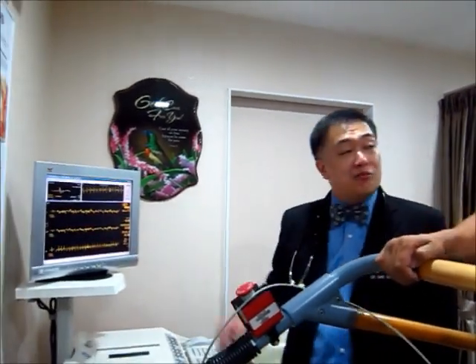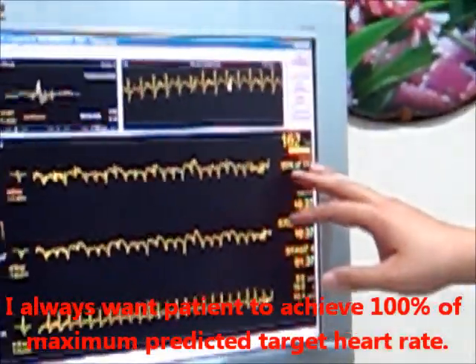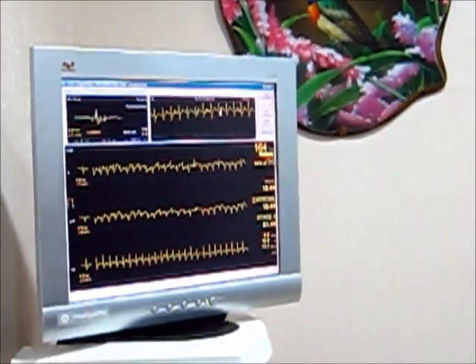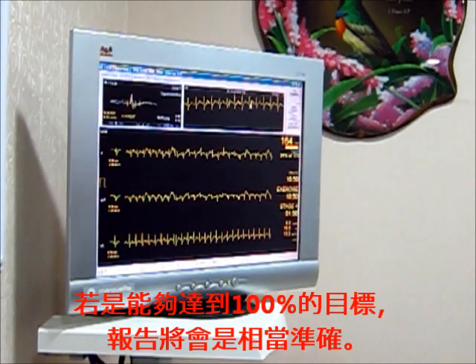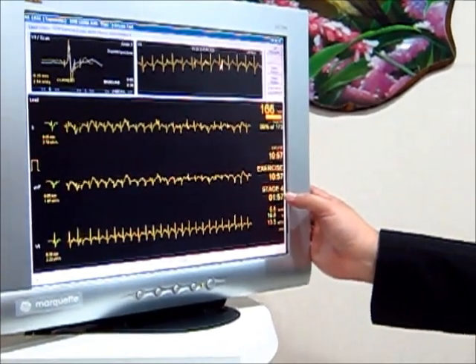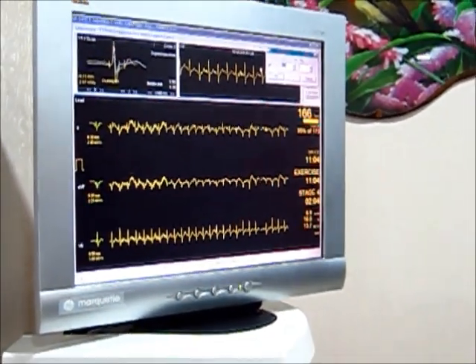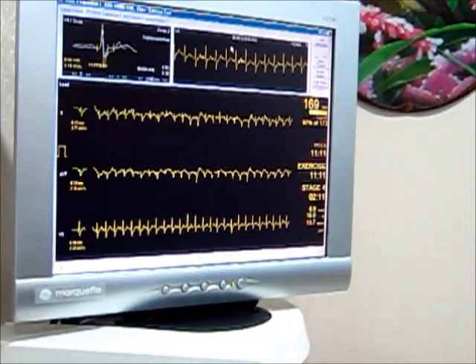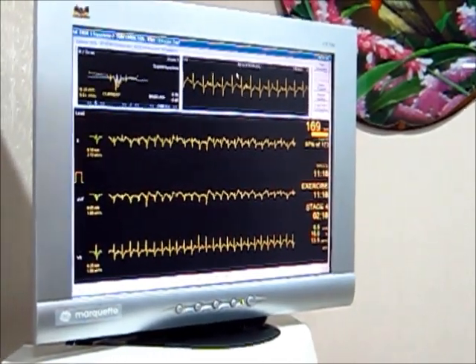Mr. Koh, you are at one and a half minutes of stage 4. Your heart rate is 162 beats per minute, with our target at 173 — you are at 93%. From my point of view, it is best to achieve 100% so that we can be very confident your heart does not have any problem. You are now at 94%. You still have another one minute and you look very comfortable. Now 95%... 97%. Very soon — maybe in 20 seconds — we are going to reach 100%, and then I will give you a warning before I slow the machine down.